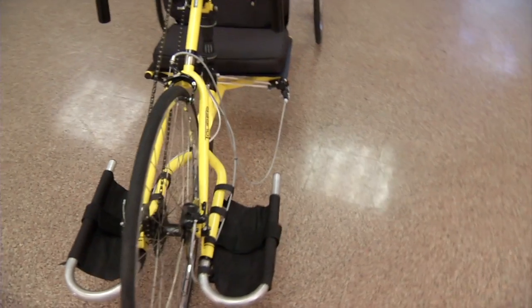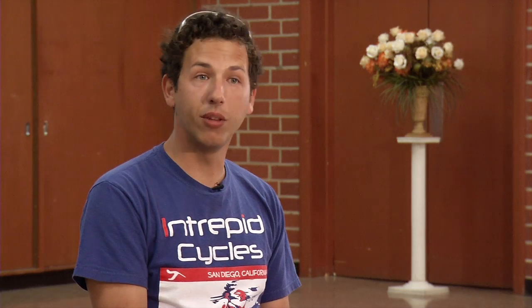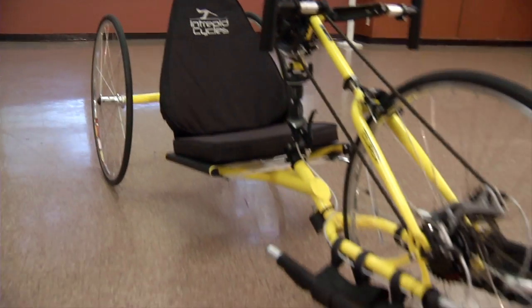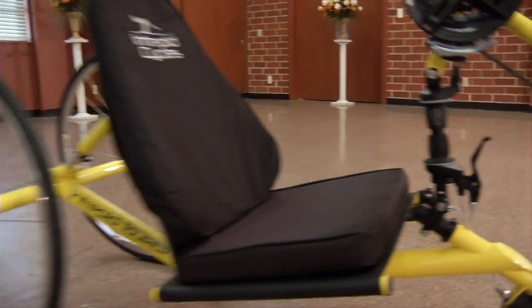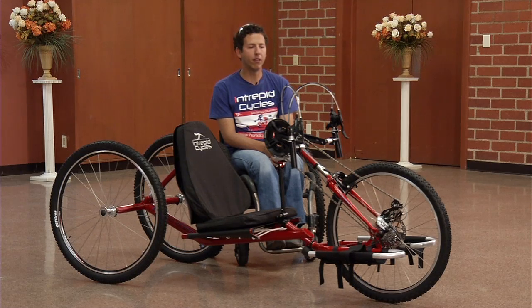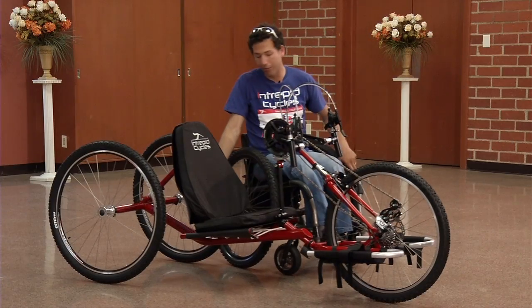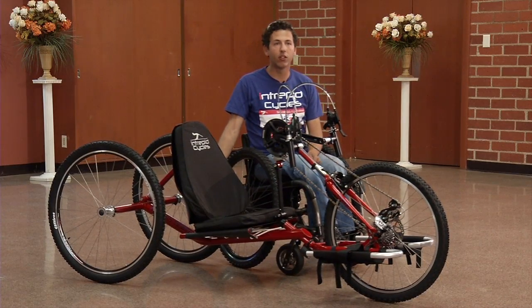The original bike we came out with was the Tourer, and it's still our most popular bike. It is certainly the most practical bike that we build, and also the most cost-effective quality hand-built hand cycle available on the market. This is the mountain version of the Tourer — we're calling it the Tourer Mountain. It's got tons of ground clearance with these enormous wheels. You've got 10, 11 inches of ground clearance.